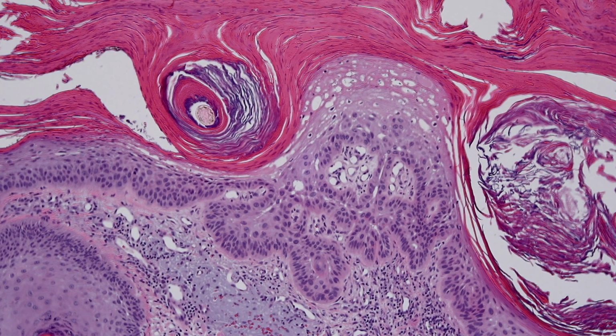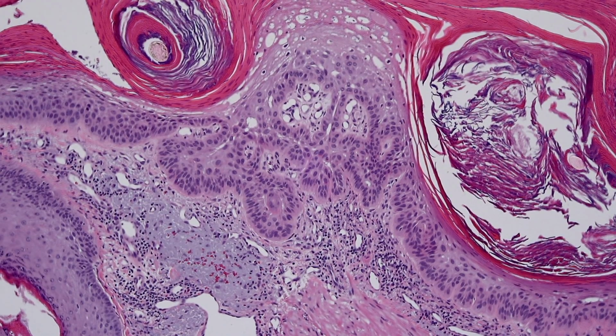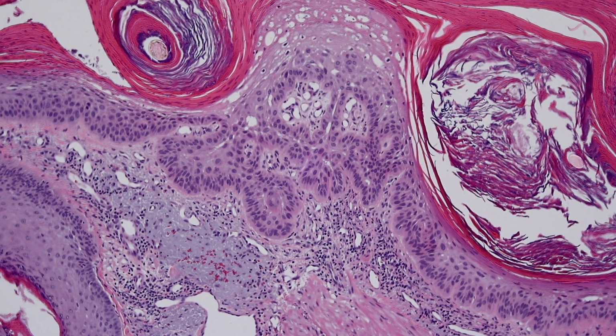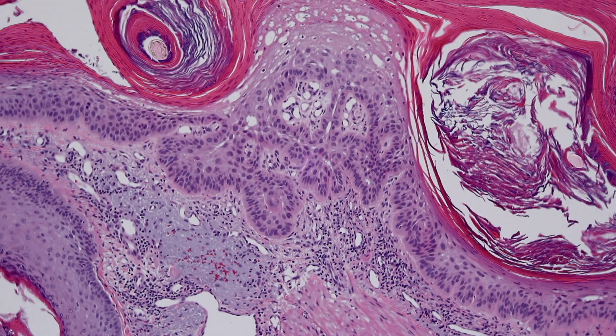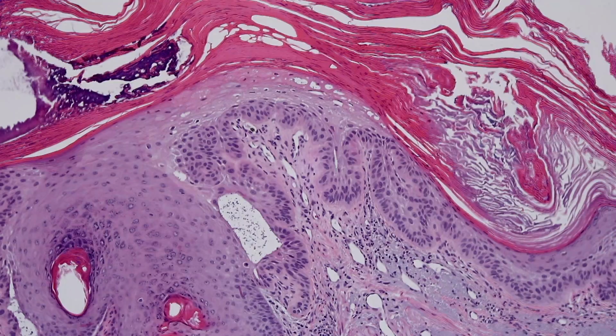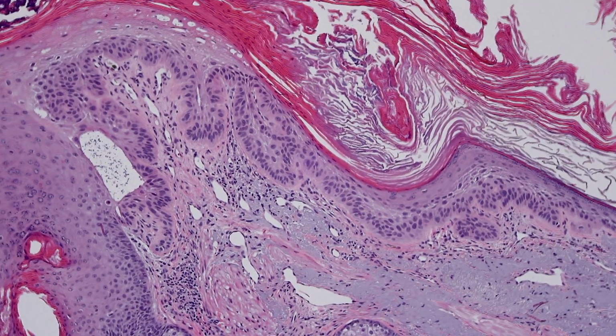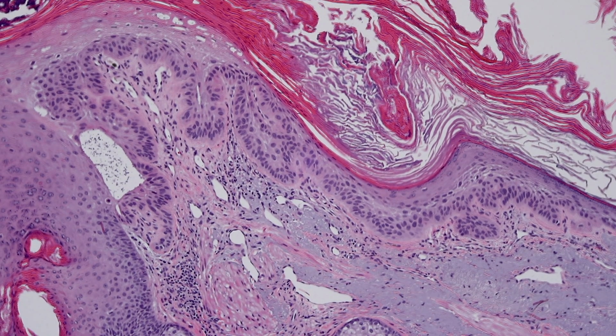And sometimes people use terms like proliferative actinic keratosis to describe actinic keratoses where there's a bunch of rete that kind of bud and push down into the dermis, but that don't seem to really invade. I used to use that term, and I found that it often confused my dermatology colleagues. They wondered, well, what do you mean? Like, what should I do about this? So I usually just don't say it now. I just decide if I think it looks like an actinic keratosis or not.